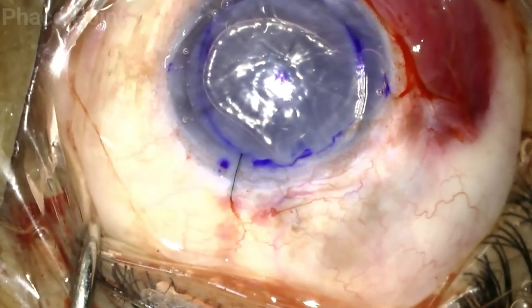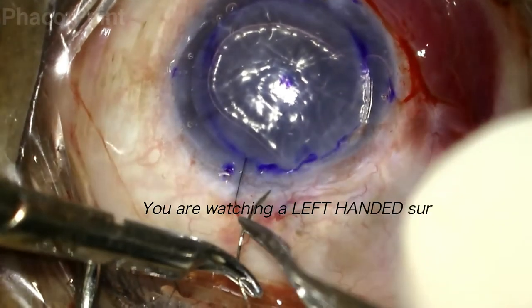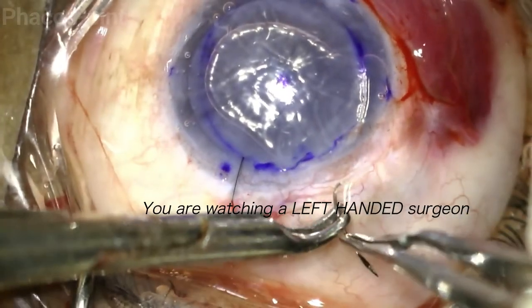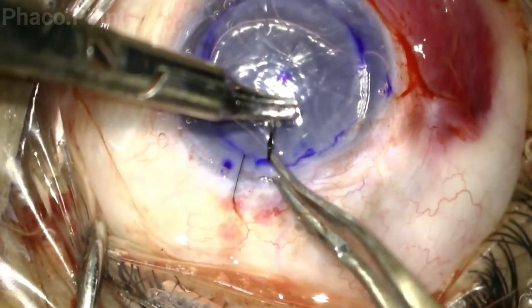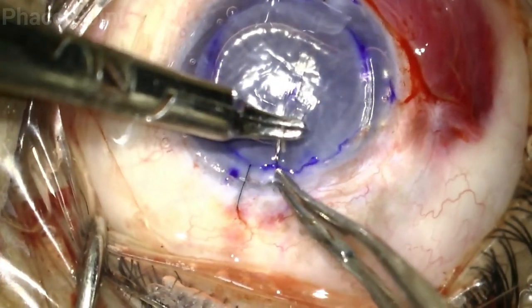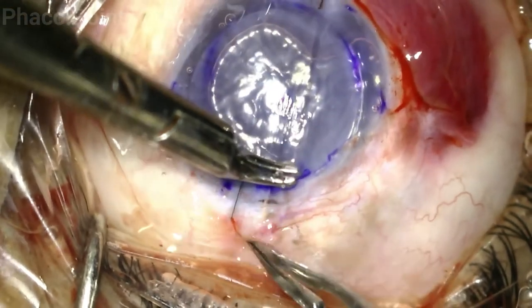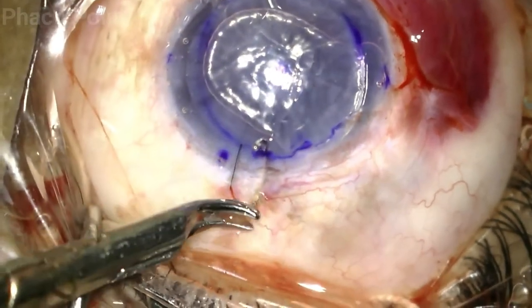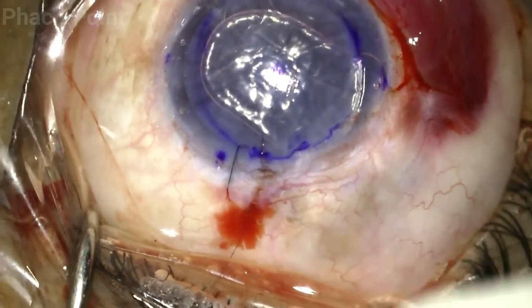The suture is held with the needle holder two-thirds away from the tip with the correct orientation. The corneal lip is stabilized and raised, and the needle passes through 80% of the thickness of the cornea. The scleral lip is then supported, the needle passes through 80% of the thickness of the sclera, and then the needle is pulled out.